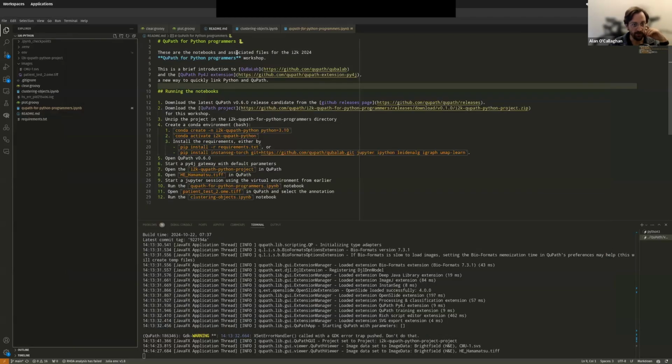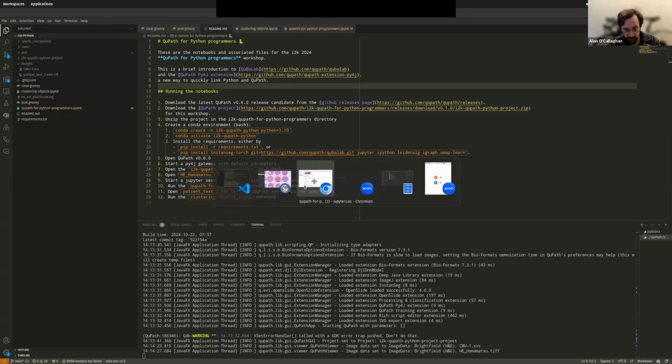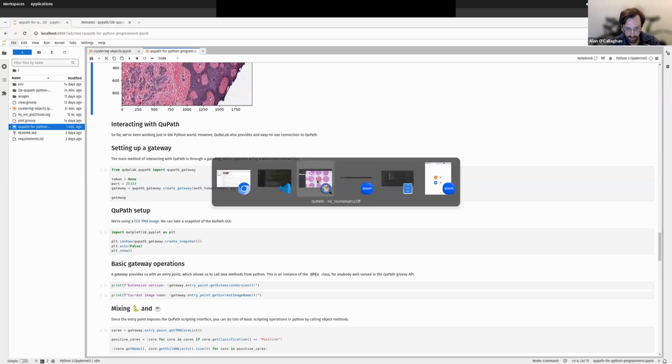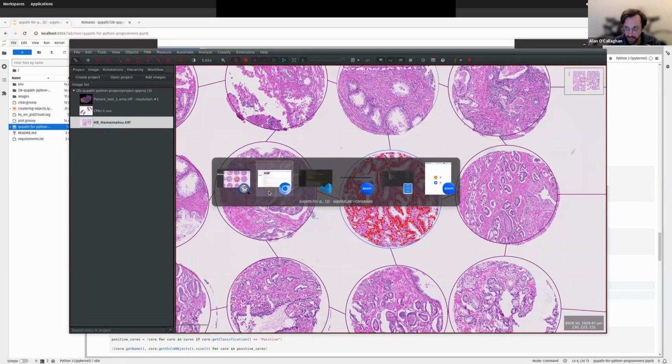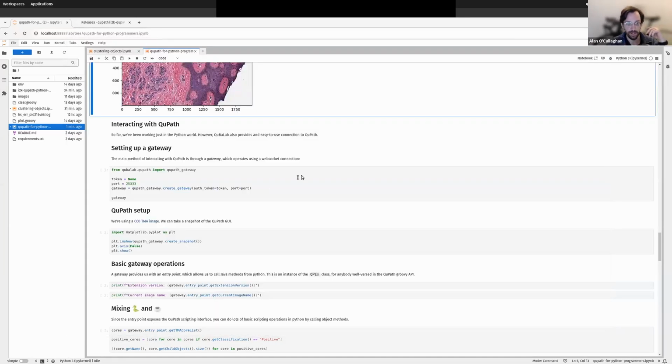So now if I go back, sorry, I'm going to hit Alt Tab again. And apologies if my mouse movement is a bit slow. I think somehow Zoom makes my computer a bit laggy, which may or may not be the glorious experience of NVIDIA on the Linux desktop for you.